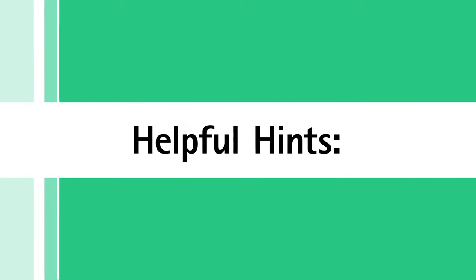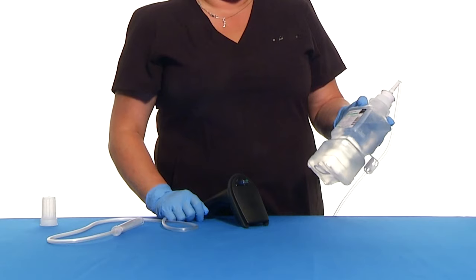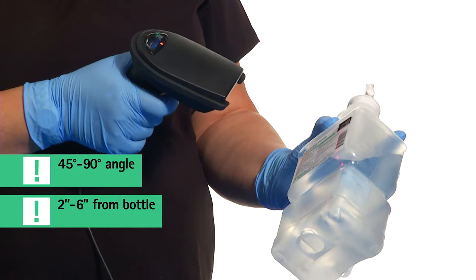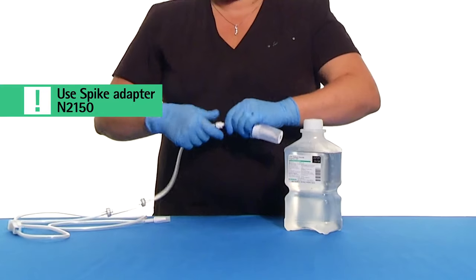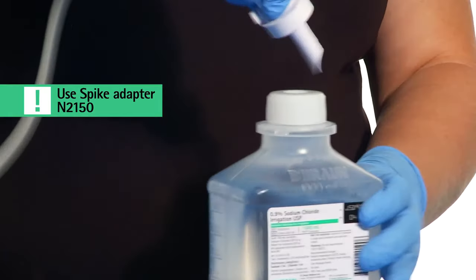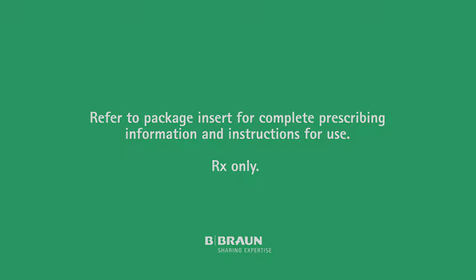Here are some helpful hints for working with the PIC irrigation container. To scan the barcode, hold the bottle and scan at a 45 to 90 degree angle, 2 to 6 inches from the bottle. Spike adapter N2150 is available to spike the PIC container.